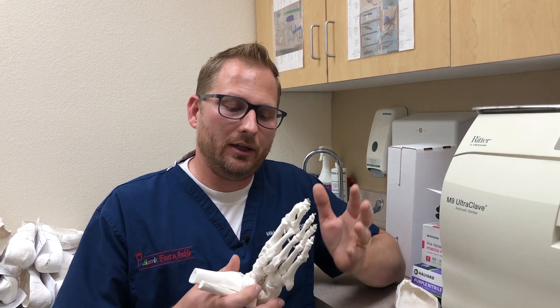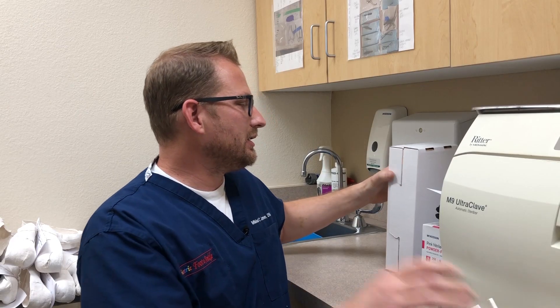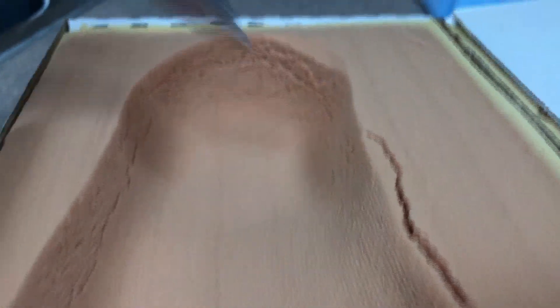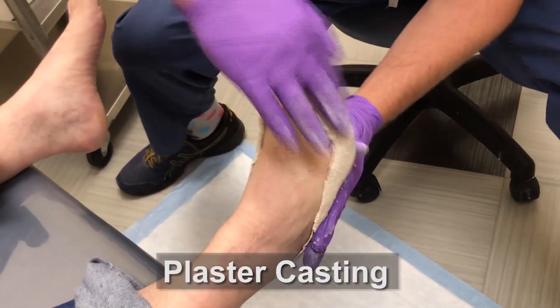There are three basic techniques utilized today to obtain an impression of the foot. One is utilization of a scanner or a pressure plate. The second method is to utilize a foam box, where a patient places their foot into the foam and we obtain an impression. The third way is utilization of plaster to cast the foot to obtain a mold.